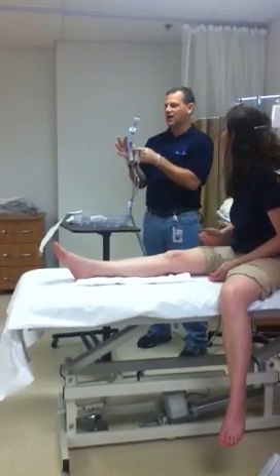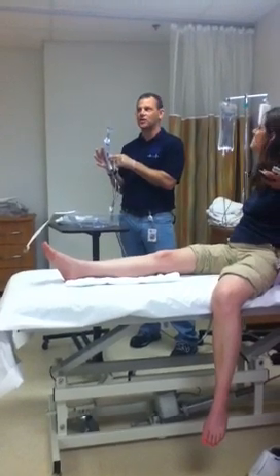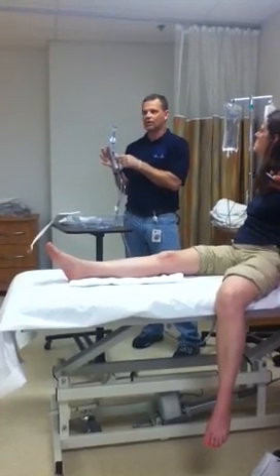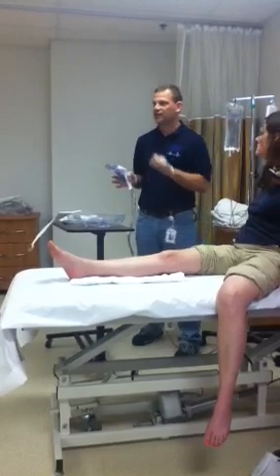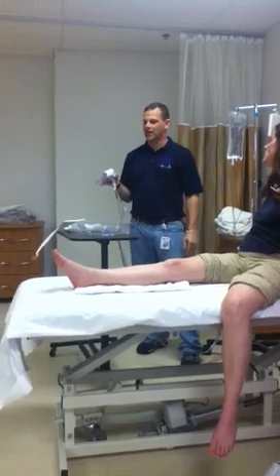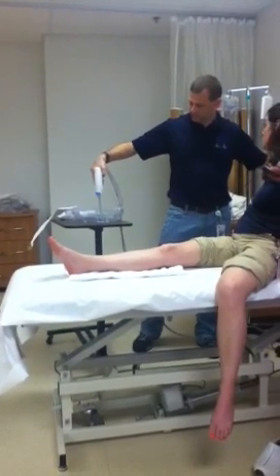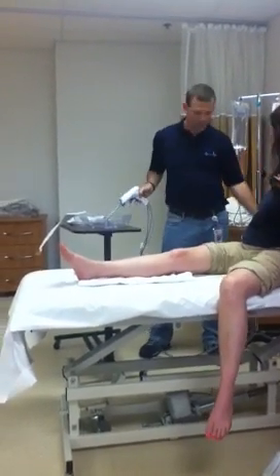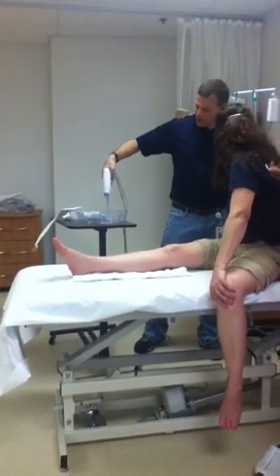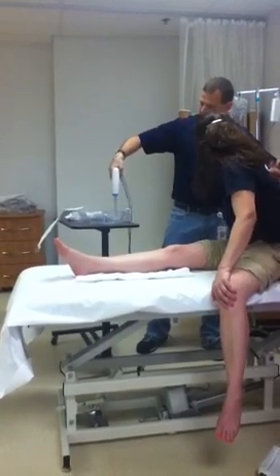On this one, if I use this end, it's the end that the orthopedic surgeon might use in surgery to clean out a bone they've cut. So if I shoot this in at her leg, I can damage her leg. I've got to use the top side of it to keep it from coming out too fast. I'll just come over here and turn it on a little bit. If I put it on you and it starts sucking up on you, then I'm going to change it.